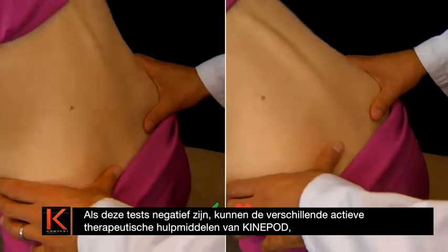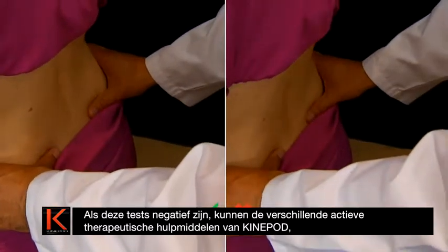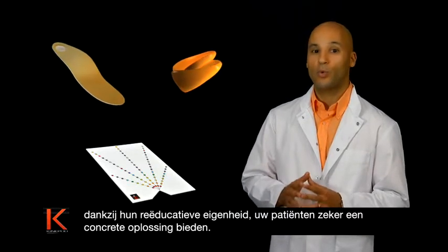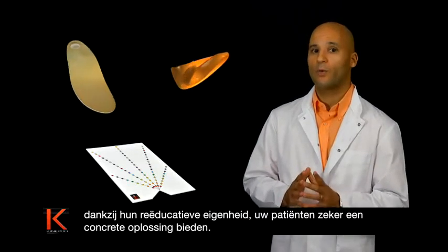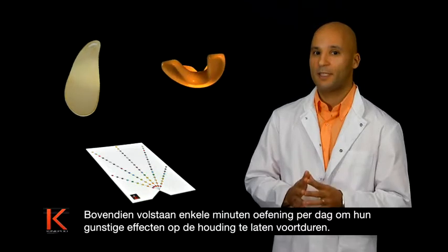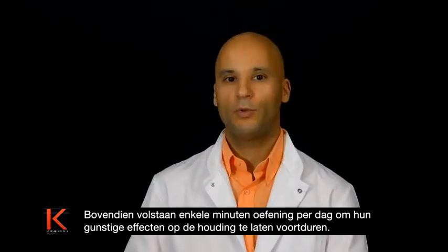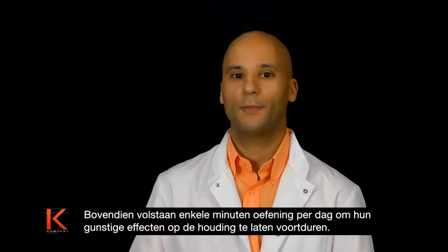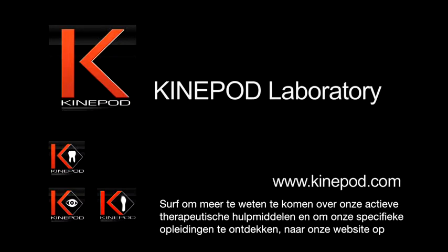If these tests are not convincing, the various KinePod active therapeutic tools are sure to be able to offer real help to your patients, thanks to their re-educative particularity. In addition, a few minutes of exercise every day should be sufficient to ensure that the beneficial effects of these tools on posture are lasting. To find out more about our active therapeutic tools and for information on our specific training courses, visit our site at www.kinepod.com.